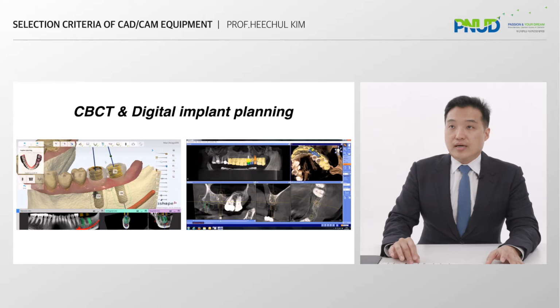Next topic is guided implant surgery. On the left is 3Shape's Implant Studio and on the right is Sirona's CEREC Guide 3. We must merge the two sets of data at the teeth using CBCT and an intraoral scanner. We can design the virtual restoration on the STL file and finalize the anatomically ideal location of the fixture using the DICOM data. Lastly, we create the bite splint, which will guide the drilling location, including the sleeve hole.